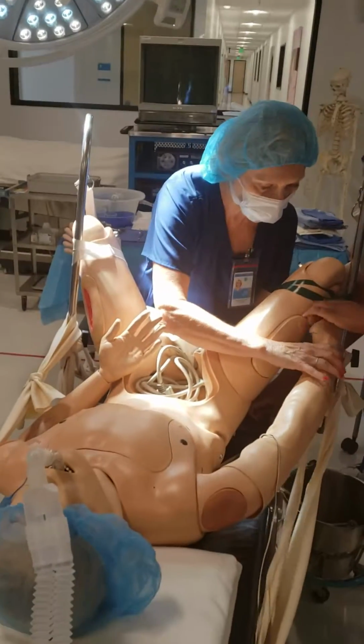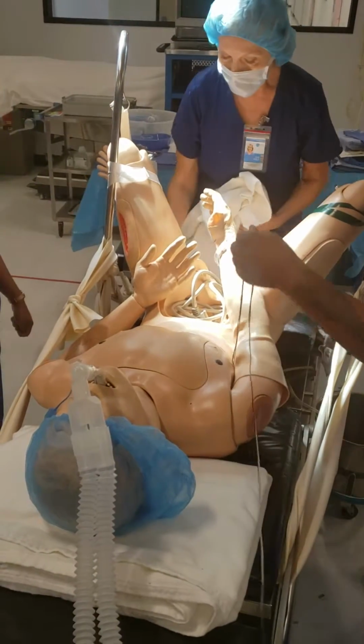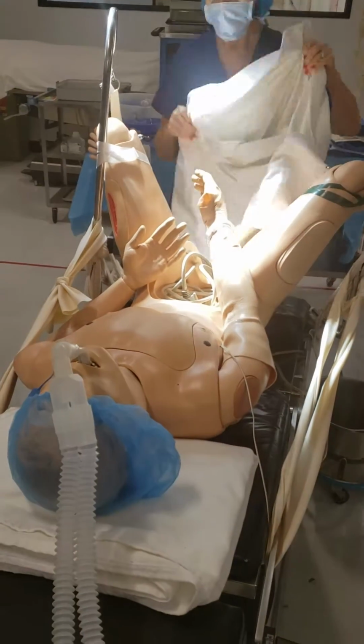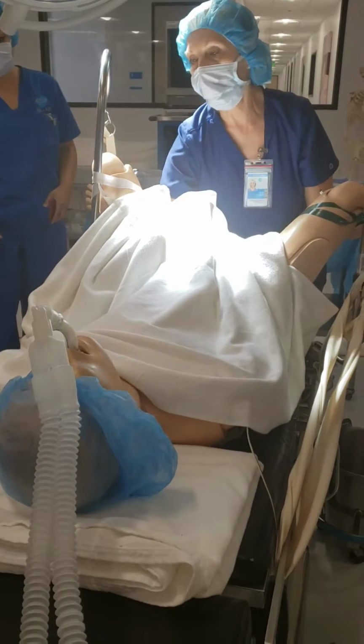Which is this position. The arms are tucked over here, but when the bottom half of the table is moved down like this, if you're not paying attention, you can get their hand or their skin caught as the table's coming back up.